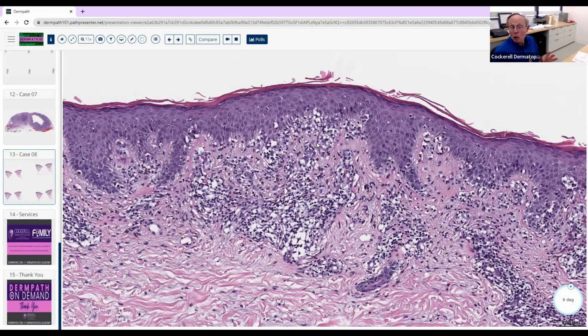It's a variant of granulomatous, quote, mycosis fungoides, which is basically, we think, the host response coming in trying to fight off the MF. But there's some other things that look histologically identical to MF, or very close to MF histologically. There's the LYP. Yes. There's a variant of lymphomatoid papulosis, and I've sort of sworn an oath not to memorize the multiple subtypes.